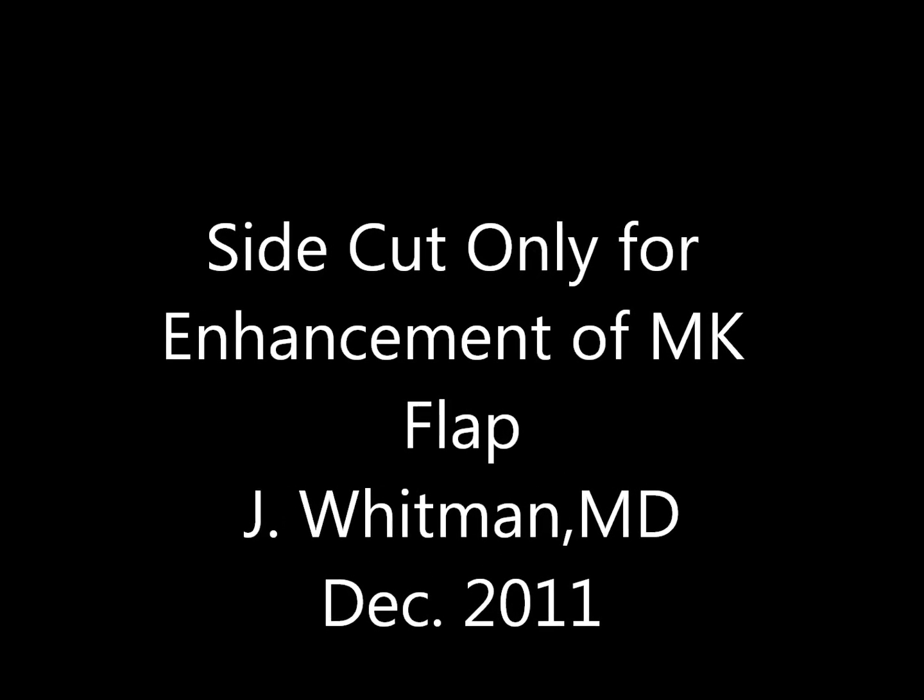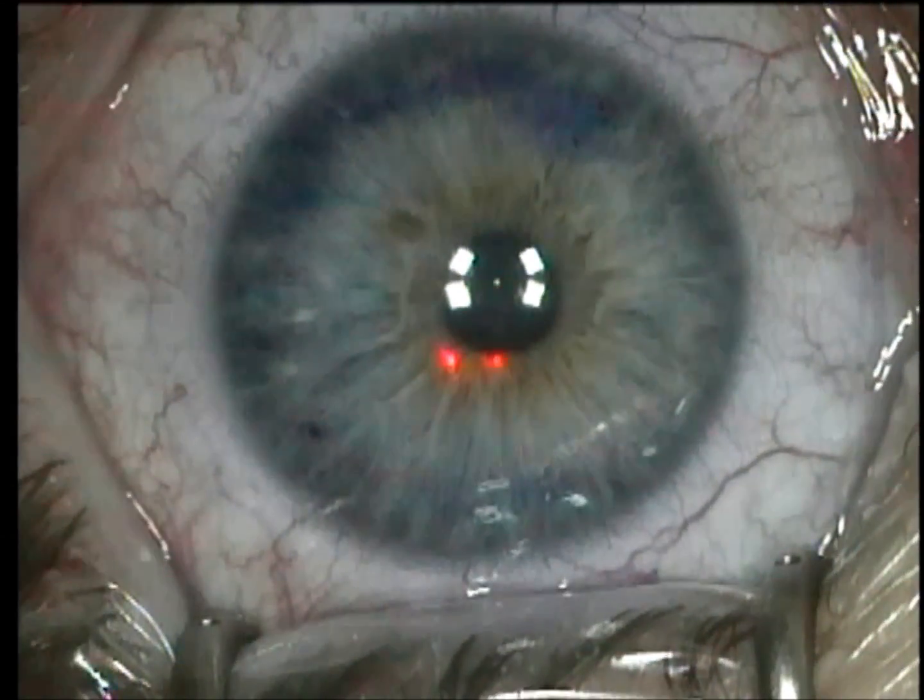This is Dr. Jeffrey Whitman and I'm going to be discussing enhancement surgery by side cut only for previous microkeratome flaps.